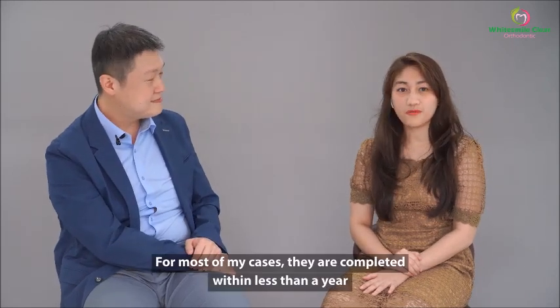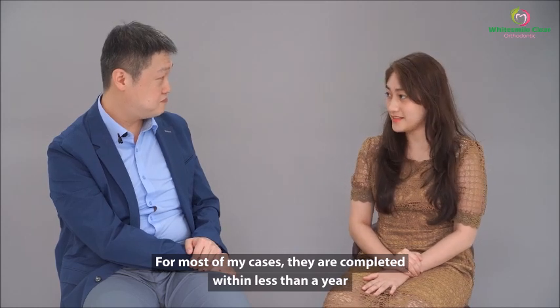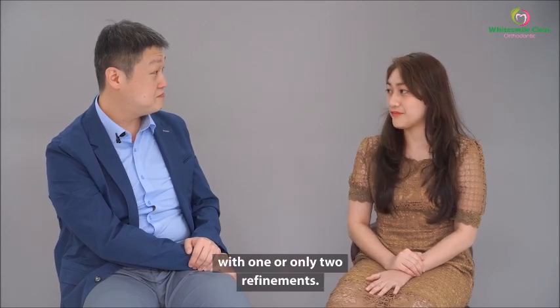As an orthodontist, I tend to see more complex cases, so my cases take a considerable amount of time. But I'd like to ask Dr. Linda here, how quickly do you see results with the type of patients that you see, which are sort of the less complex cases? You know, just the six front teeth being aligned. For most of my cases, they are completed within less than a year, and with only one or two refinements.